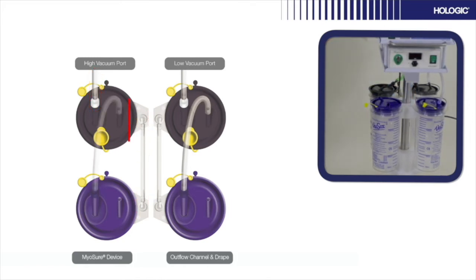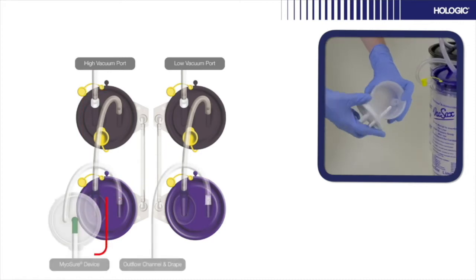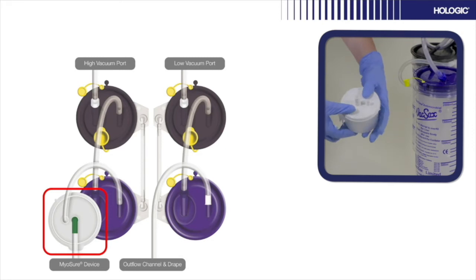Next, attach the tandem tube from the front to the back canisters as shown. Blue always to the front and ensure a tight seal at both ends. Finally, on this side, you need to connect the VacSax tissue trap. Before attaching onto the canister, check it is securely sealed by removing the lid and ensuring it is tightly fitted.